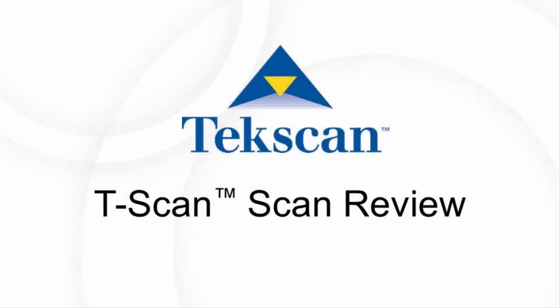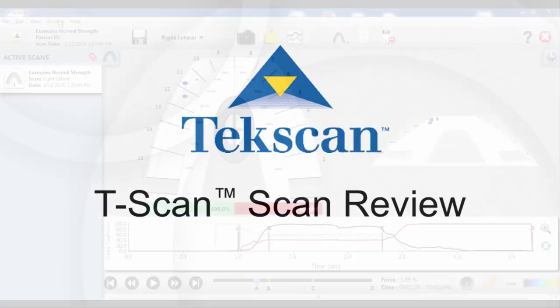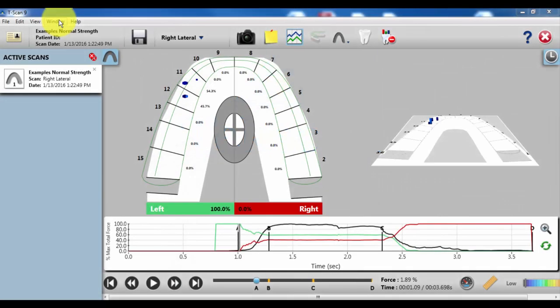All right, in this training demonstration we're going to go through a closure for balance and then additionally the scan we're looking at has a right lateral excursion attached to it. We'll focus on what to look for during excursions to help us make good adjustment decisions.